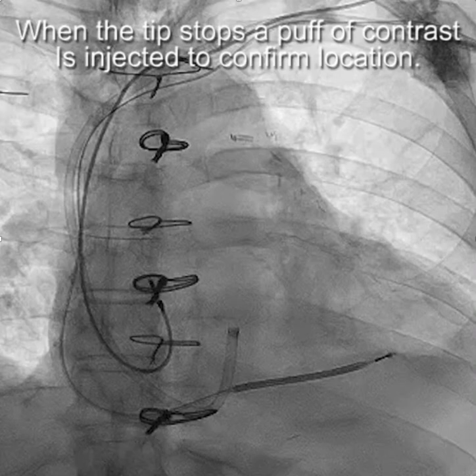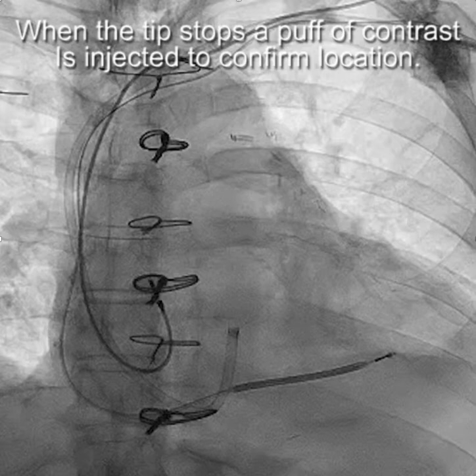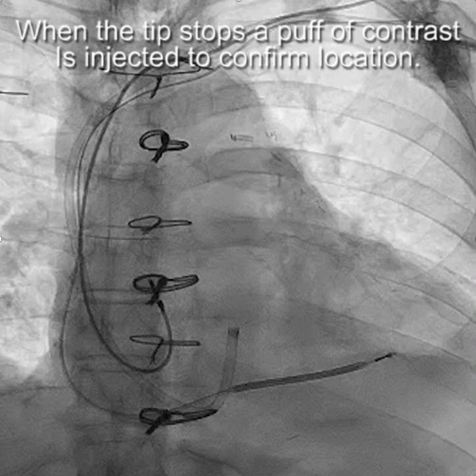I hope this helps you understand coronary sinus cannulation and why the shape of the catheter is so important to successful cannulation.